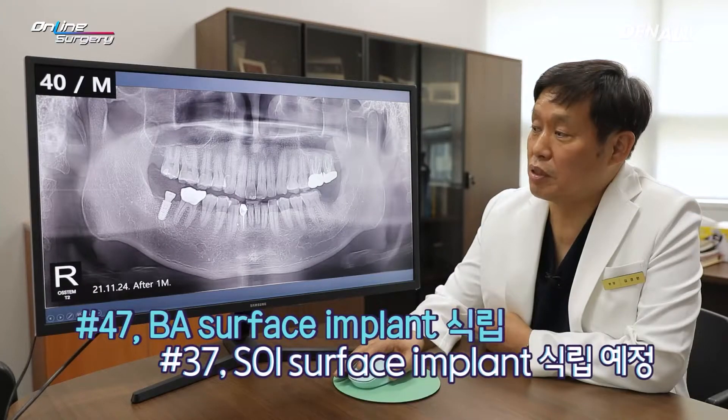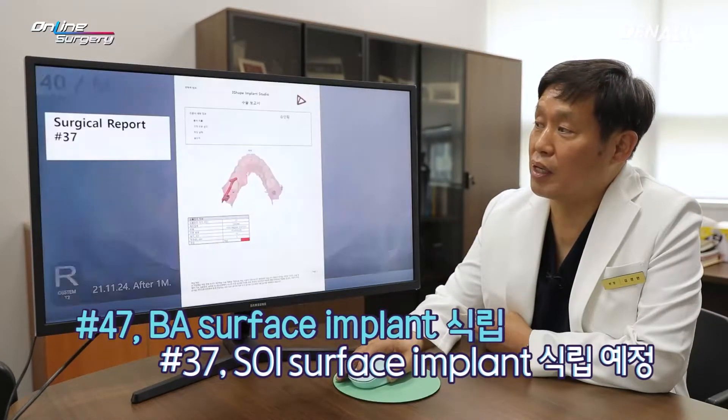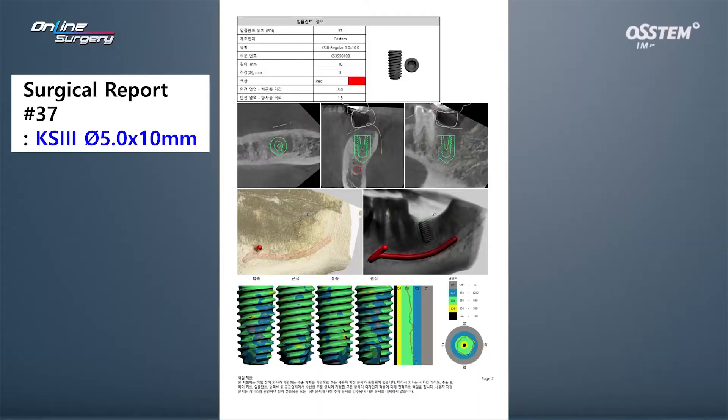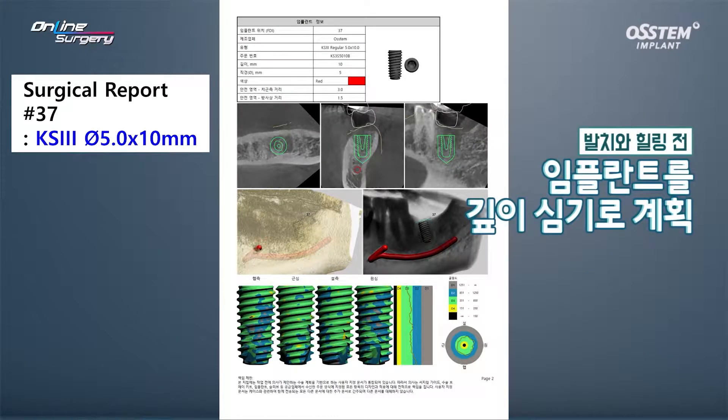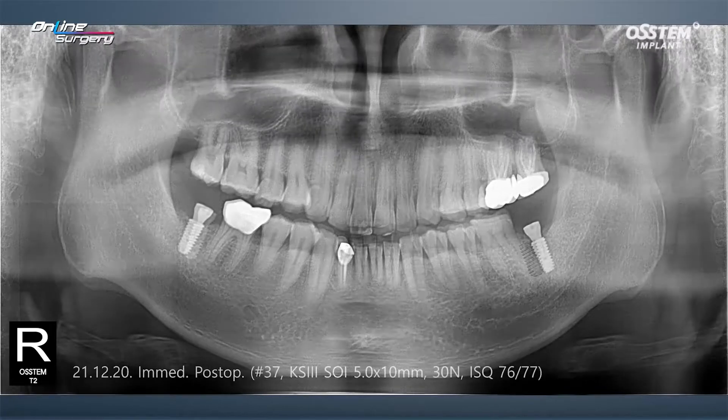In number 37, an SOI implant is going to be placed. Position will be secured using one guide. The extraction socket is not fully healed, so I plan to place the implant a bit deeper. In the case of SOI surface, it is good for dealing with blood clot, so I anticipated good healing within the extraction socket. I did not plan for bone graft.